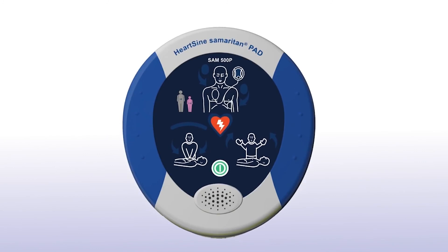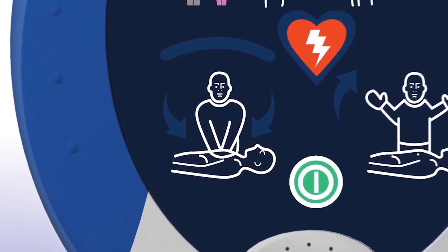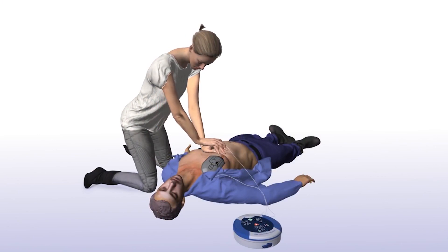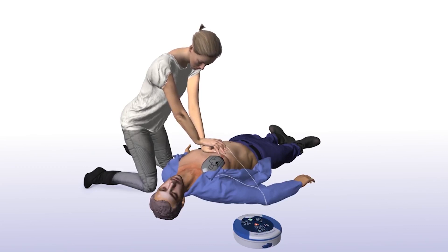When performing CPR, it's important to apply effective chest compressions for each 2-minute cycle as directed. The SAM 500P with CPR Advisor will prompt you to begin CPR and will continue to do so until you begin chest compressions. It will tell you how and where to place your hands, as well as provide real-time audio-visual feedback on the rate and force of your chest compressions.